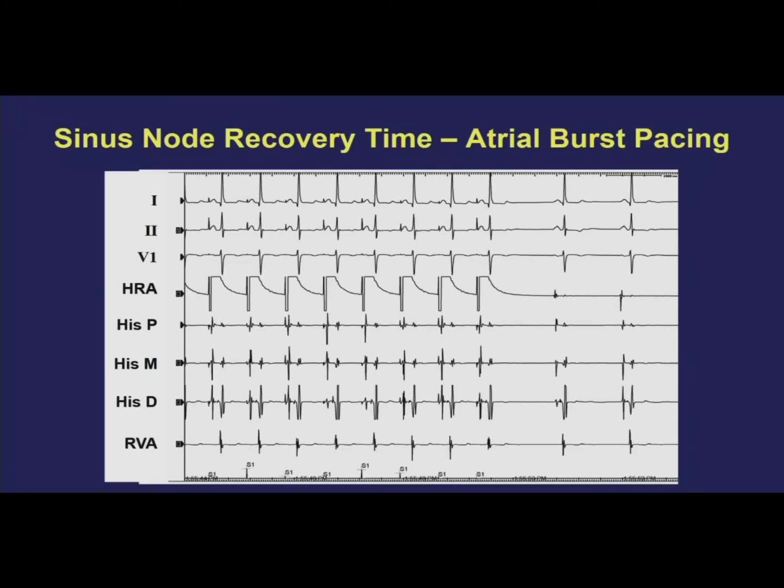If someone has presyncope or syncope, whether it's with a Holter monitor or an implantable loop monitor or their Apple Watch, we almost always can get a recording of the rhythm during symptoms. That didn't used to be the case. They didn't have these long-term monitors to catch events that happened less frequently than once per day. And so you had to do EP studies to try to see, does this person have sinus node dysfunction that may be an explanation for their syncope?